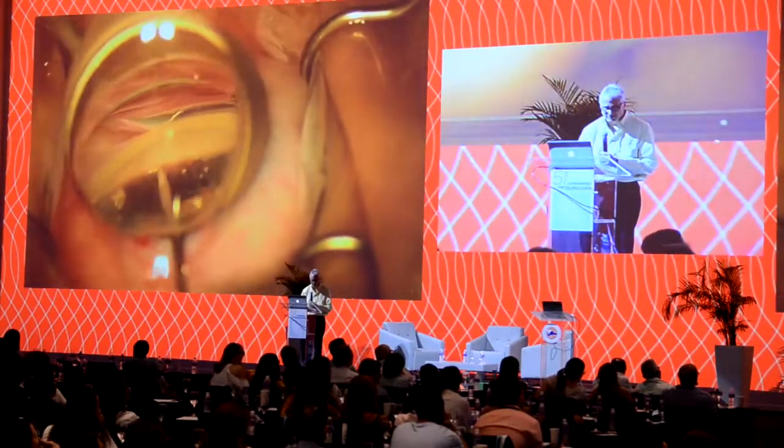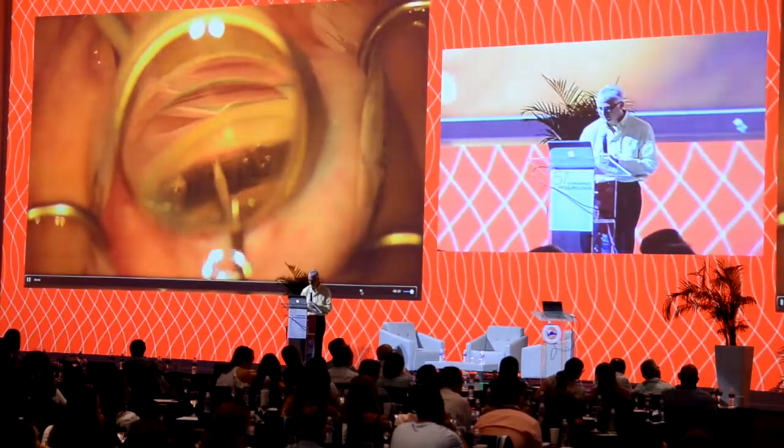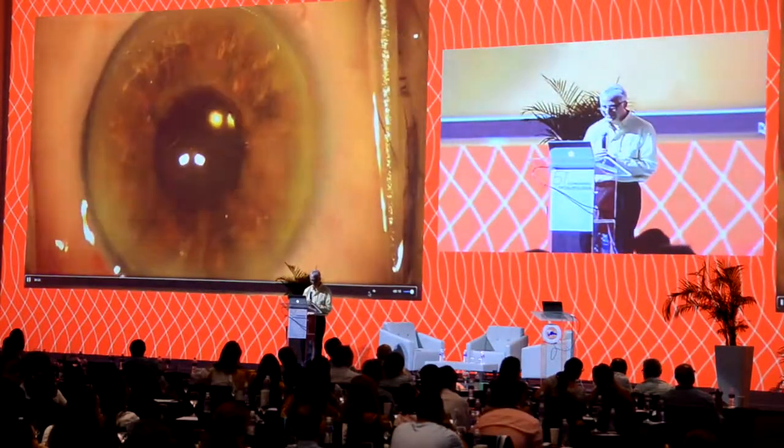And remember the eye stent that they weren't able to get in the first time? Well, we put that in while we were in the neighborhood as well. Ike always gets excited when I place a glaucoma stent. It's always very fun for him.